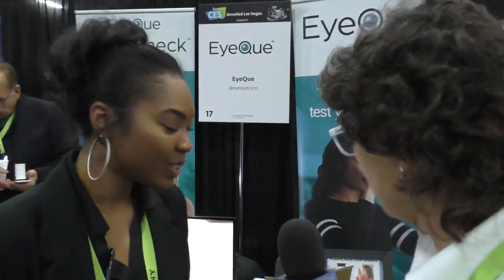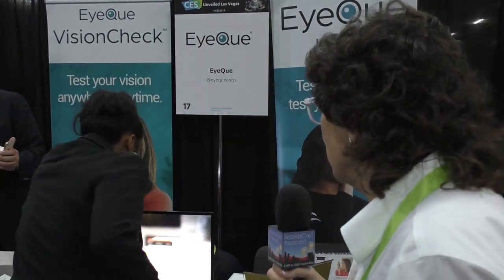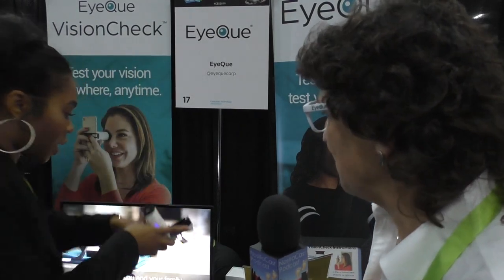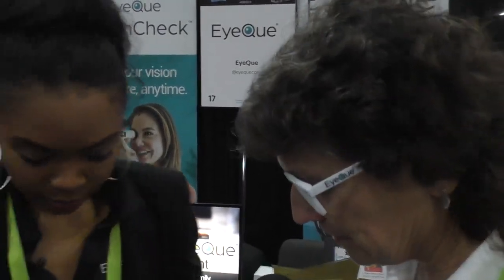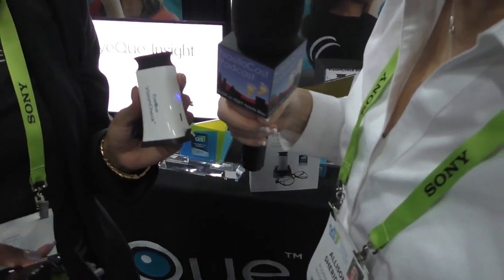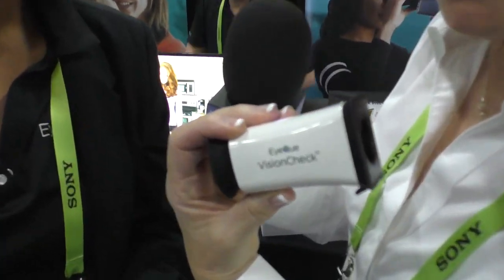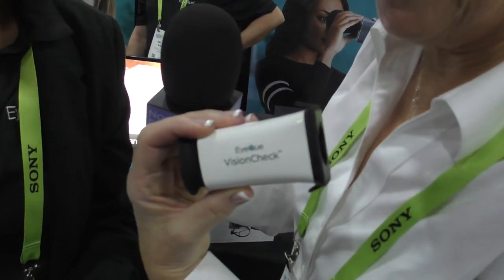Warby Parker will require a full prescription, but other websites like Zenni Optical and I Buy Direct let you enter your own information, even your own prescription. Now, what is the other device — the Vision Check? She's grabbing one from behind the display. It's a piece of optics that attaches to the front of the screen on your phone. This little device you just use with the app.